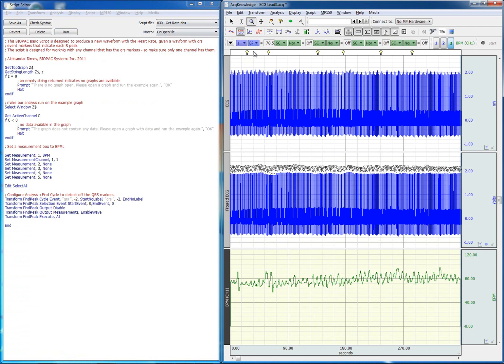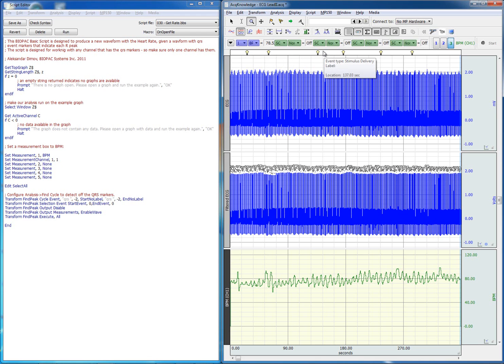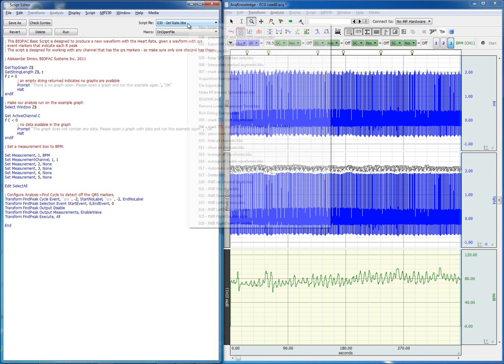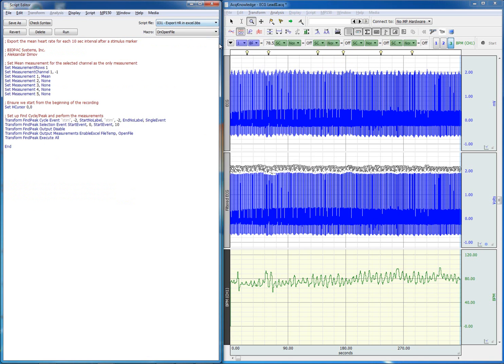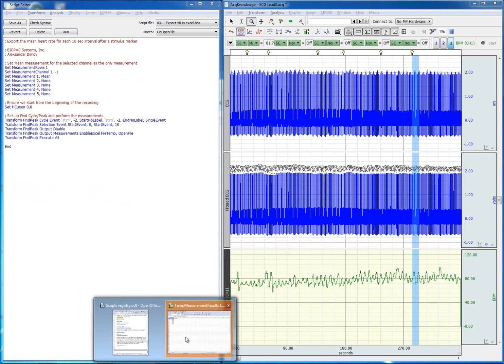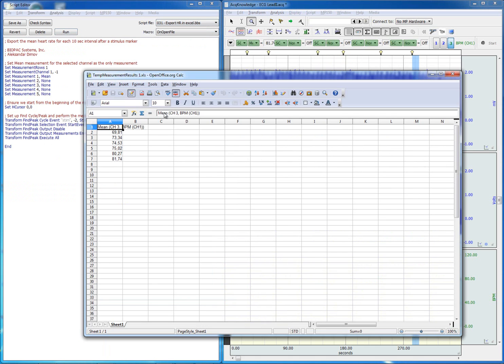Finally, given that we have all of these stimulus delivery events we can use another script to give us the mean heart rate for the 10 seconds following stimulus delivery. Let's go ahead and run it. And now we have the result in Excel.